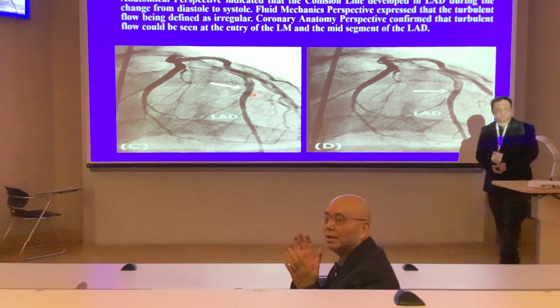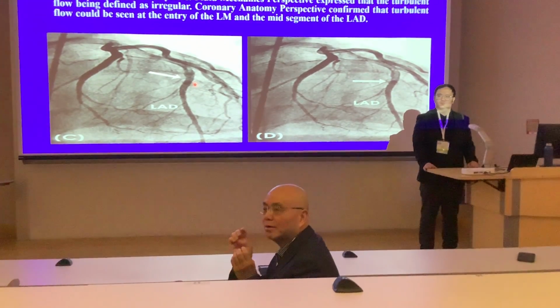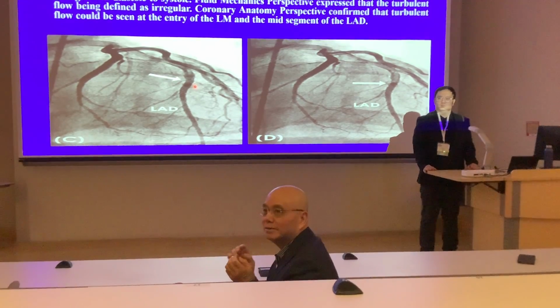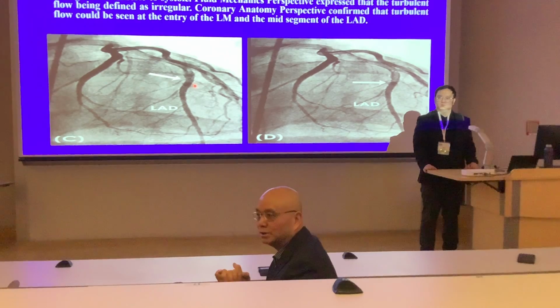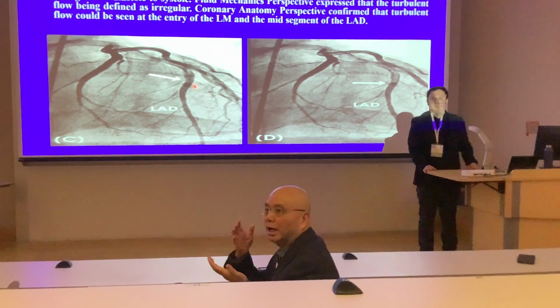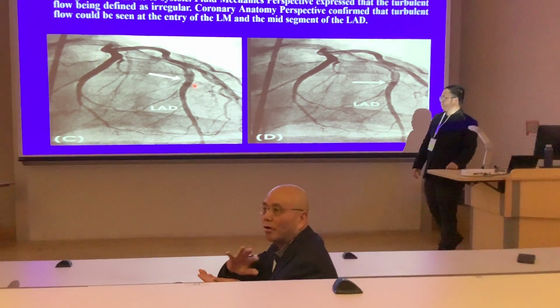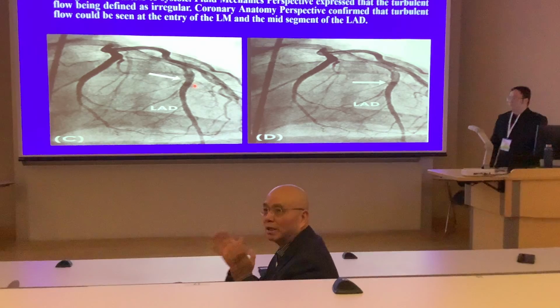It's due to severe distal vascular resistance, heightened vascular resistance. So then we gave the medication to control the blood pressure. Three days later, I did an angiogram, angioplasty for another artery, not the one causing the acute MI. We could stage angioplasty like that.